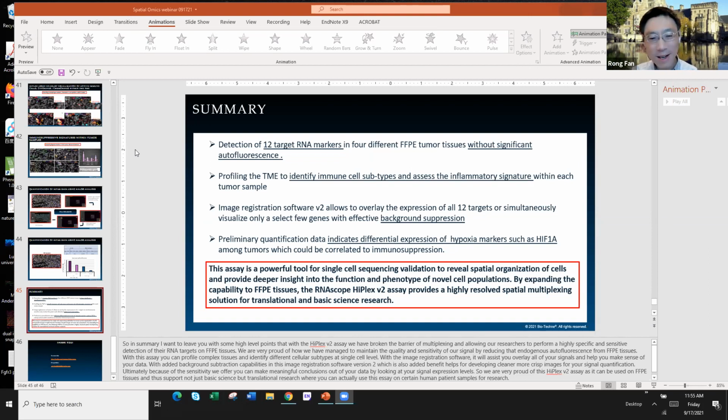So I wonder, and it's probably not just for RNAscope, but for all other in situ approaches, whether any kind of normalization, once you get the data and quantify it, and batch correction are also helpful for this type of in situ gene expression data analysis.